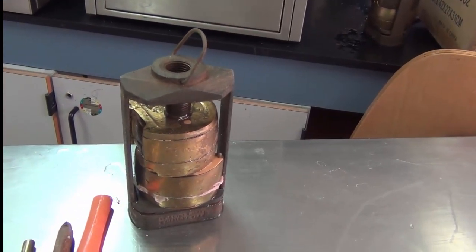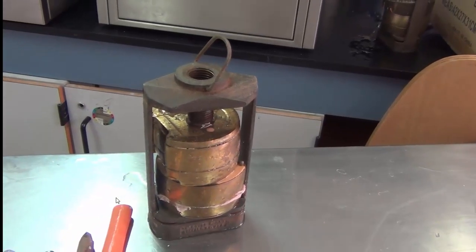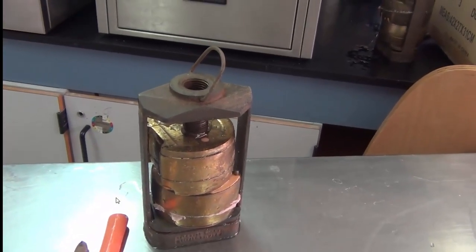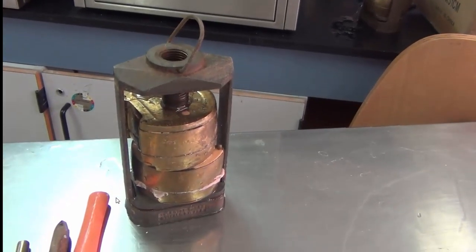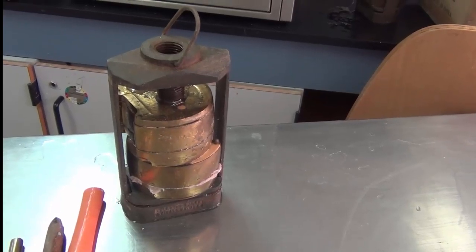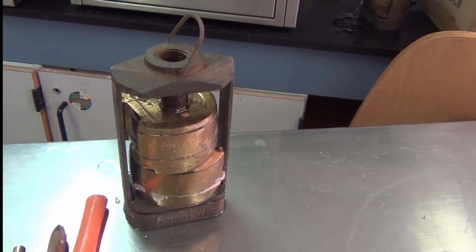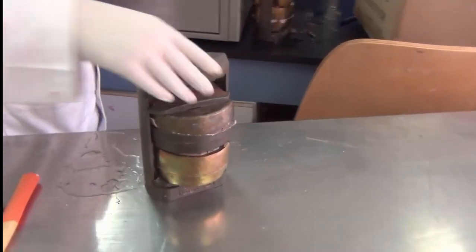It's better to cool it this way. We don't want unwanted contractions because of the cold water. If we cool it under running cold water, the surface might cool down while the center is still warm, and this will cause some internal stresses in the denture. So we leave it to cool down in room temperature. We have another one that has already been cooled down, and it's ready to be opened.